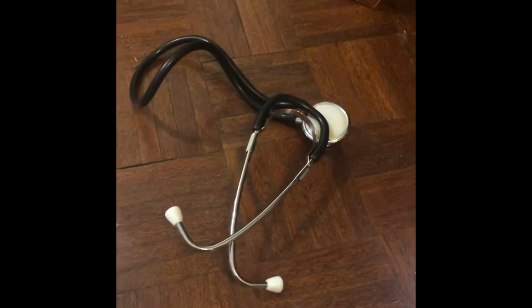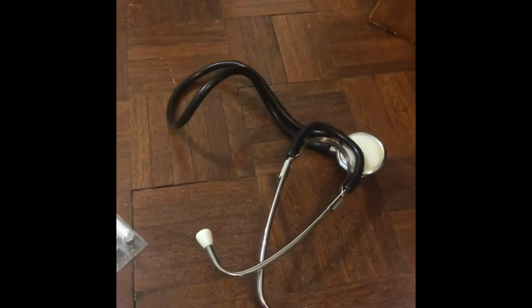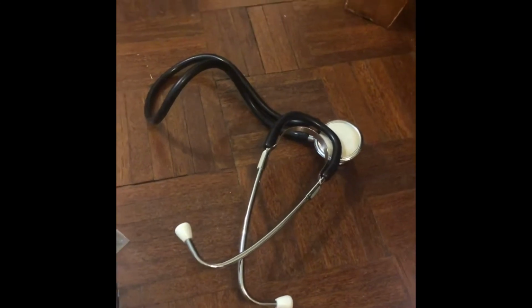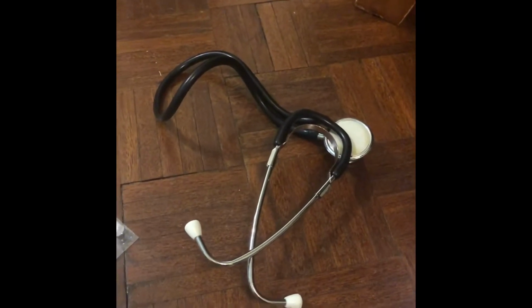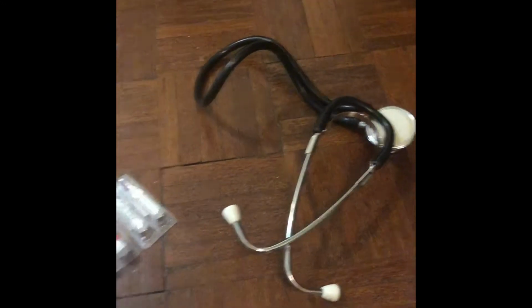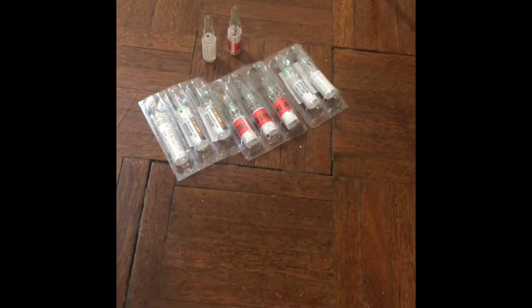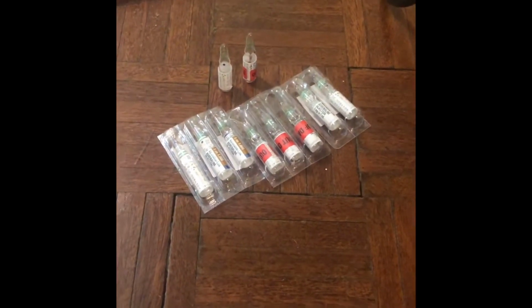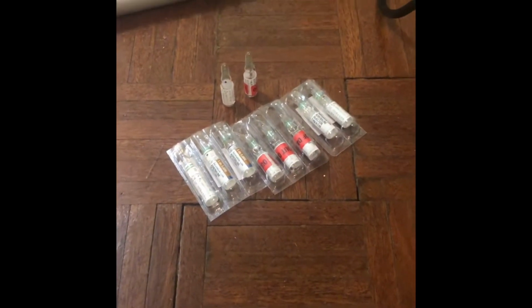So after the tube's been passed, we're going to want to have a listen to the chest to make sure there's equal air entry, the epigastrium silent, equal rise and fall of the chest, and end-tidal CO2 showing a good waveform. We're going to make sure we have some vasopressors available. Probably not all that expired adrenaline, but something in case of some hemodynamic instability.